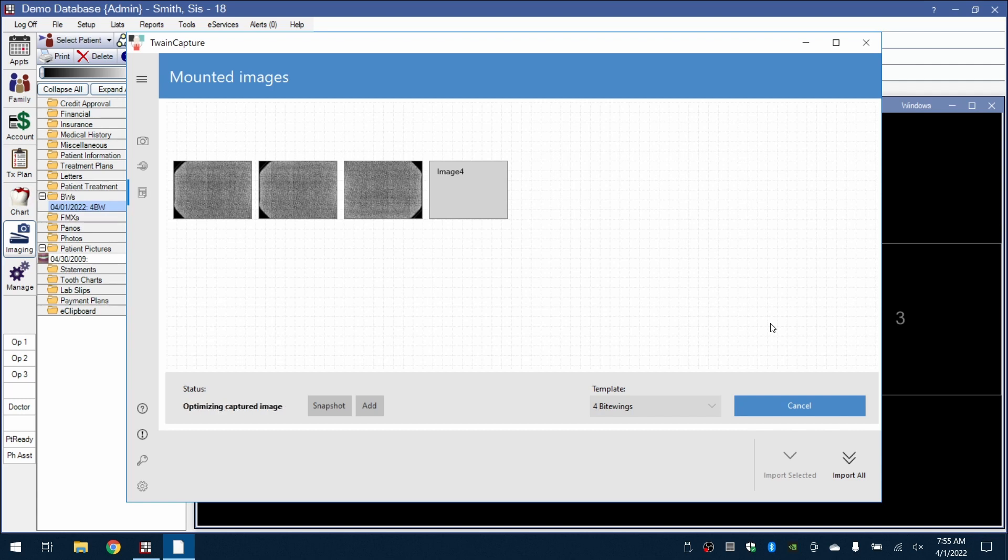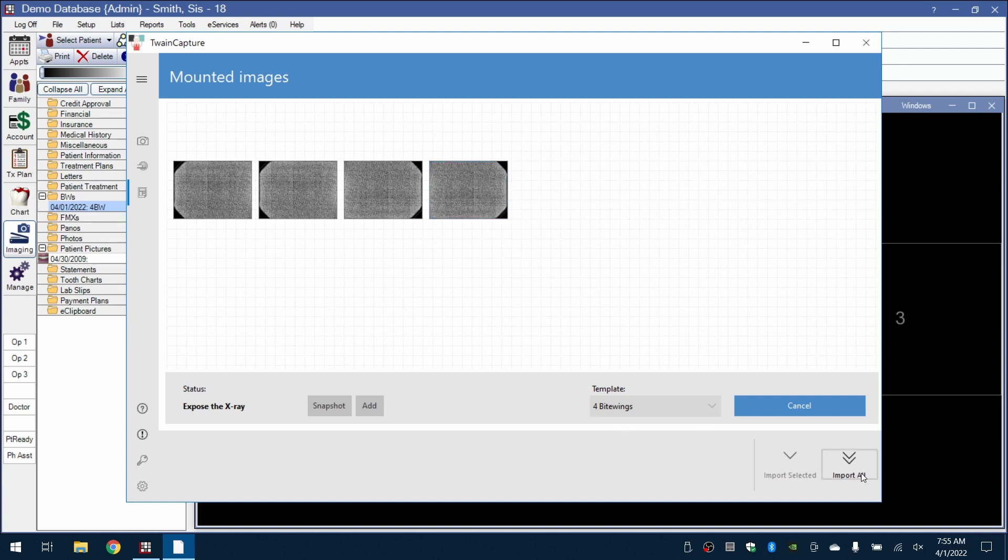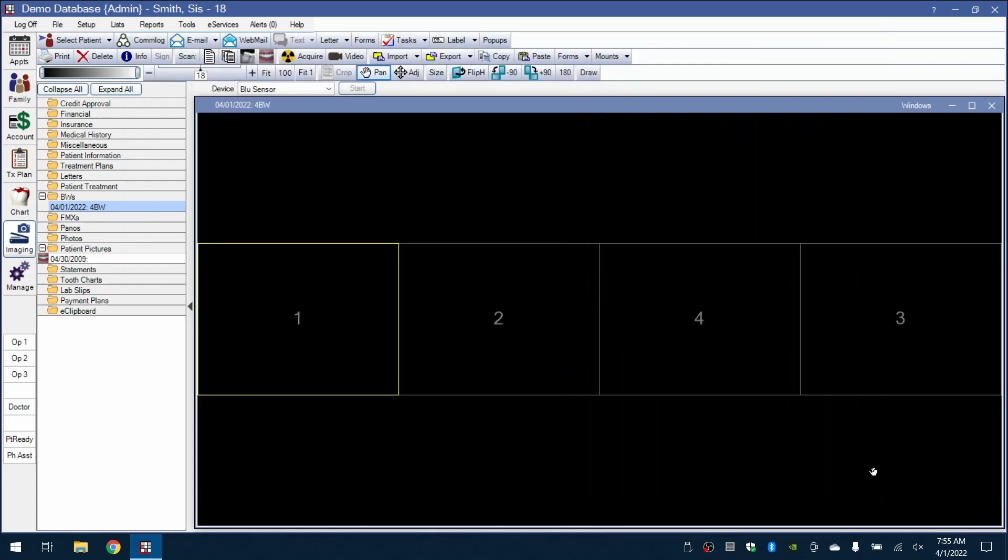After our exam is complete, we'll click on Import All in the bottom right corner of the driver window. The images will then transfer to Open Dental's mount system.